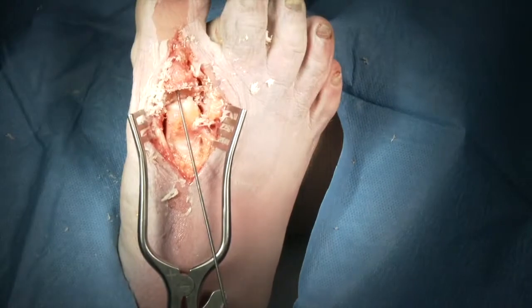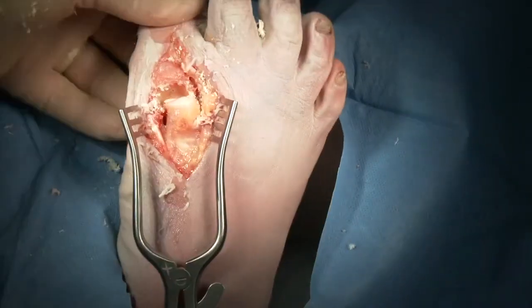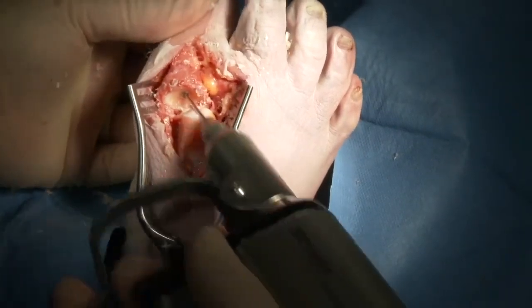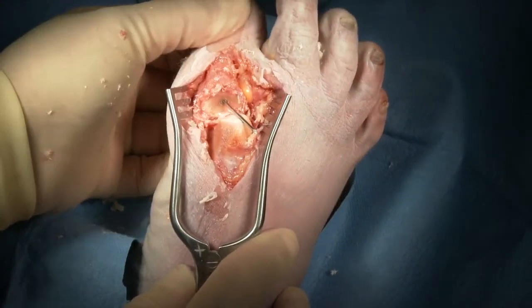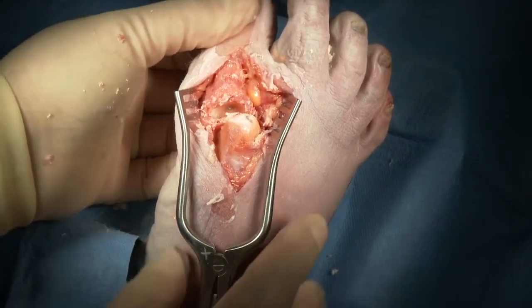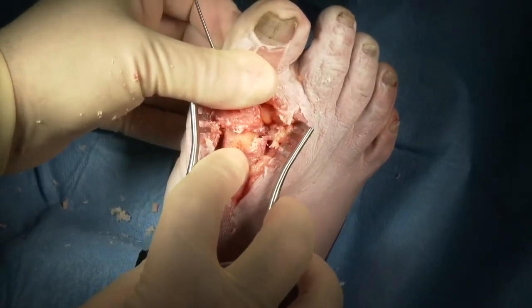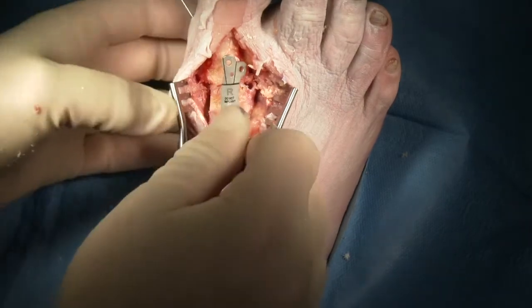Once these surfaces are prepared, we'll remove the guide wire that was placed for the reamer and check the reduction of our joint, making sure that the joint surface is symmetric. We can then place a temporary pin for fixation going from the proximal aspect of the proximal phalanx out distally medially, pulling the pin just below the joint surface. We then reduce the joint, make sure we have it in the appropriate position with 15 degrees of dorsiflexion and 15 degrees of valgus, and drive that pin back across for temporary fixation.